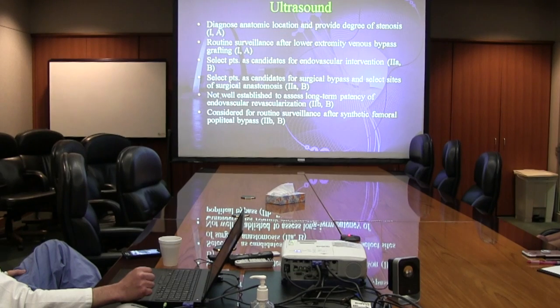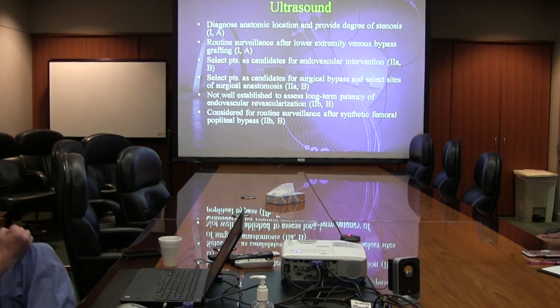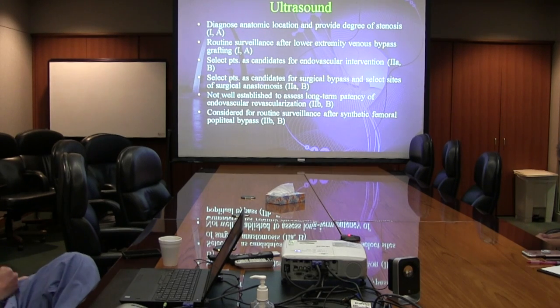So, duplex ultrasound. Now we're talking about doing an ultrasound of the arteries. We can step down the arteries and look at an ultrasound image of the vessel, but also the flow. Measure the velocities at different levels.